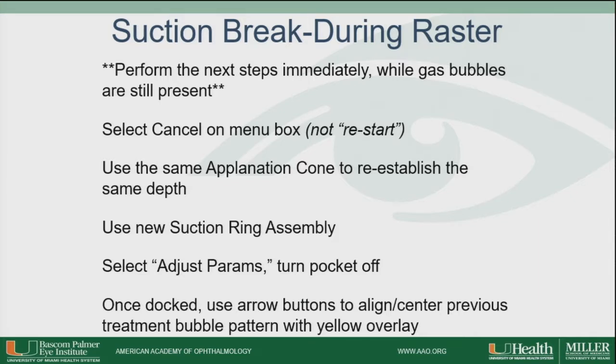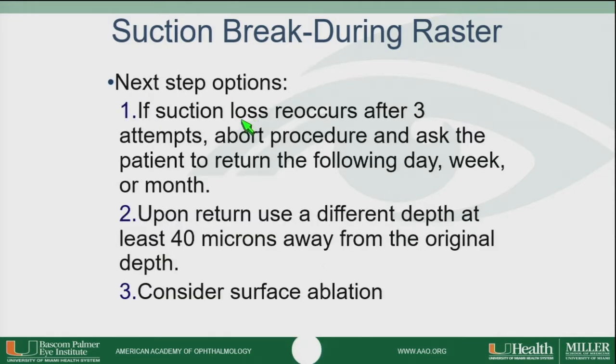And once docked, you can use the arrow buttons to align the center of the previous treatment so that you're within the previous area of lamellar cut.